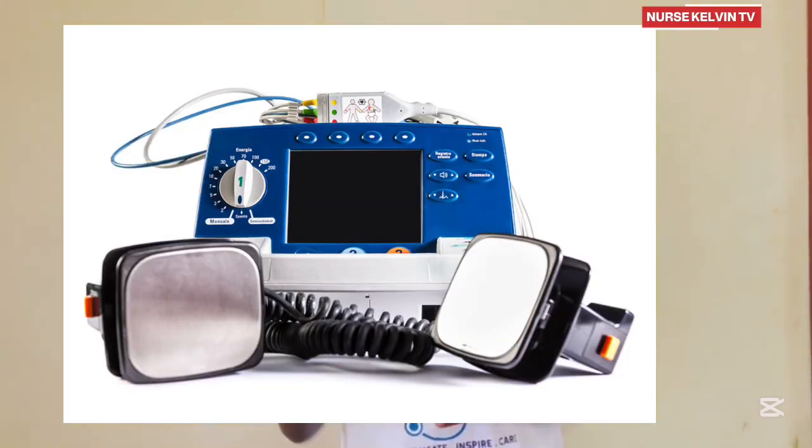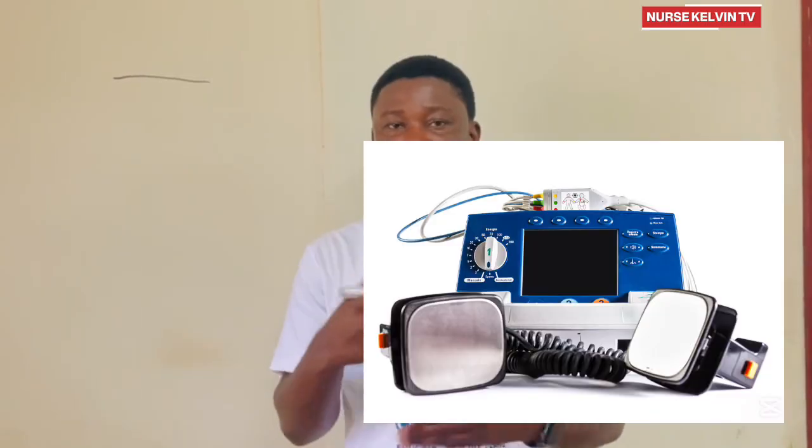Then the next one that we are going to talk about is the defibrillator. When we talk of the defibrillator, it's a device that delivers a controlled electrical shock to the heart to restore the heart rhythm.